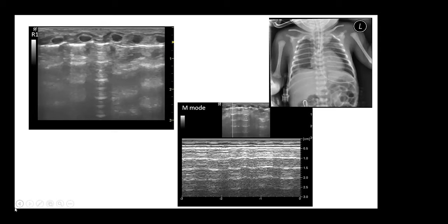To start off with, when I started learning lung ultrasound, I would look at the pathology on the chest x-ray and think about what I would see on lung ultrasound. Then in the course of my learning, I went back to doing lung ultrasound first, thinking of my diagnosis, and then doing a chest x-ray to validate what I think after clinical correlation. And now I think I've reached a level where I feel I don't need a chest x-ray. So all of you will go through this gradually, and using the chest x-ray to interpret your findings would be fantastic.